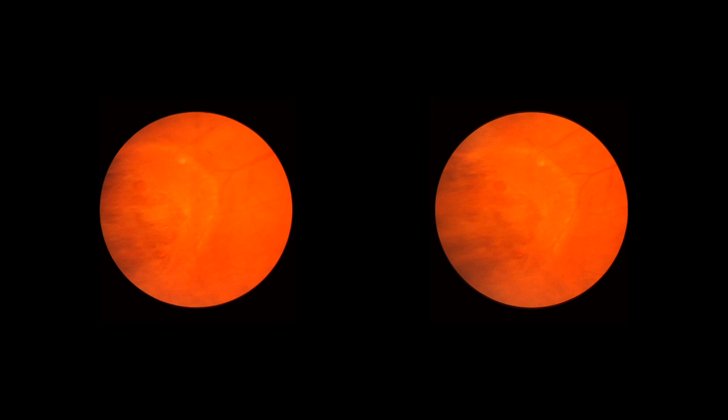5 years later still, the appearance was as shown in this slide pair, with the subretinal fluid now extending slightly beyond the lattice lesion, as far as the curved row of tiny yellow exudates seen just to the right of the center of the slide. It is now actually a small subclinical retinal detachment. The next slide pair will show this better using scleral indentation.